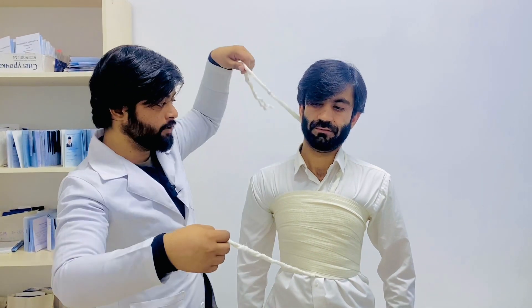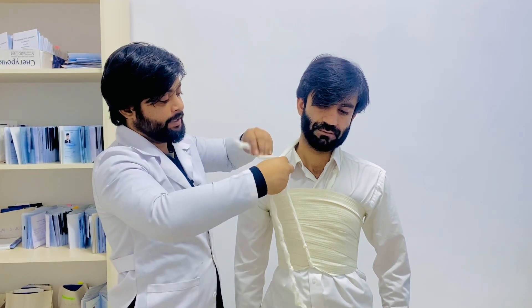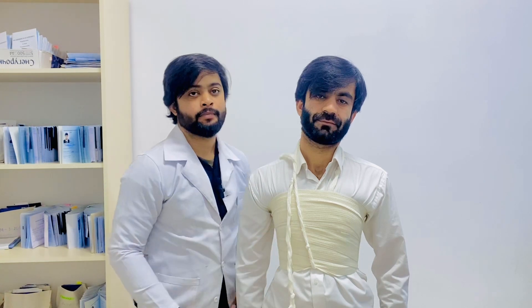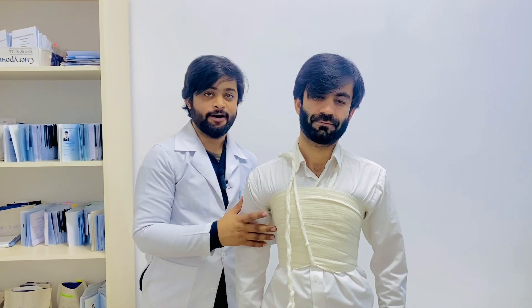In the end, what you will do is just take one rope like this, and one rope from this side, and notch it here. This is the spiral bandage — we also call it the harness. Thank you.